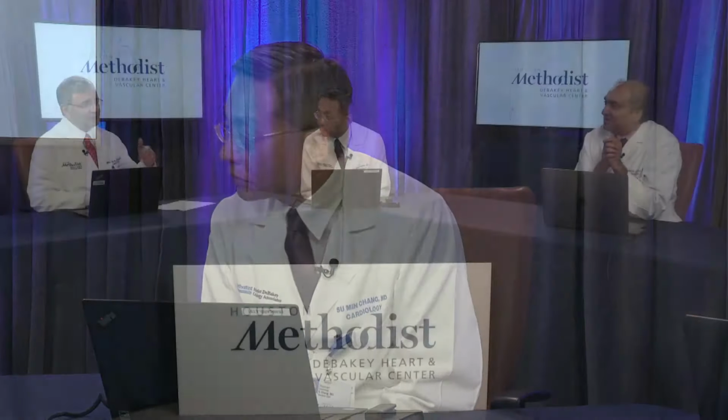We have encountered some cases where CT was done and we suspected three paravalvular leaks, and on TEE, unfortunately, we were only able to see two and could not exclude the third one, for instance. So I think it is very important for fellows or whoever performs the procedure to review any available study before we do the procedure. Very important. Yeah, I agree with that 100%. We don't want to layer one study after another after another.